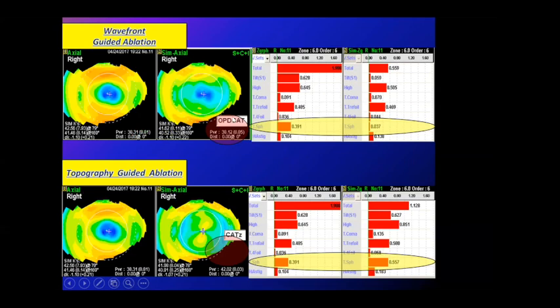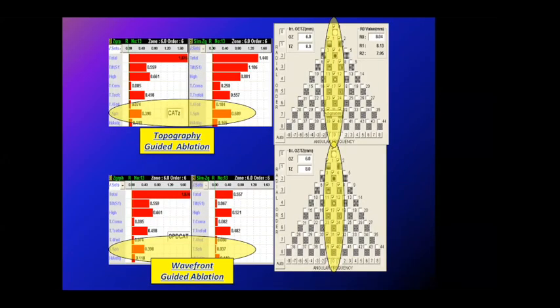Dr. Sami, again, the same. Hello. When you say here in these two slides, topo-guided treatment, what do you mean by topo-guided treatment? The PTK that you were talking about? No, I mean, if you use topo-guided treatment, you will not get any benefit. Yeah, I know, but what's the meaning of topo-guided treatment here? Is it the PTK that you mentioned before? No, no, this is not PTK. This is topo-guided wavefront treatment. Yes, exactly. So this is the real topo-guided treatment.